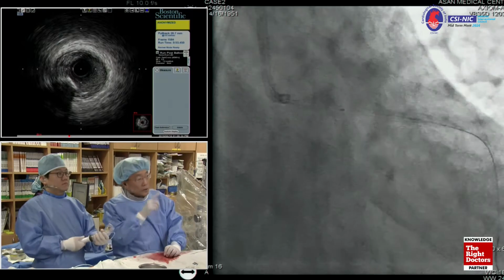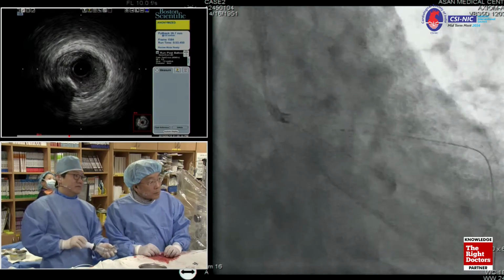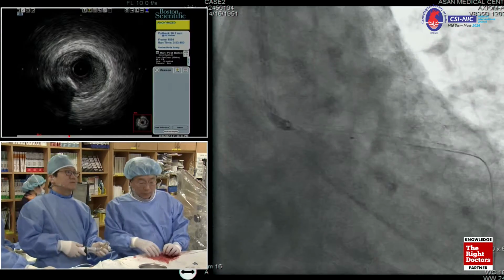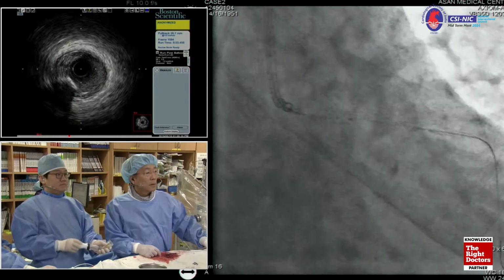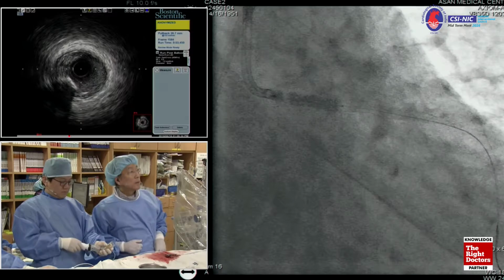High pressure. This is circumflex. I think we're running out of satellite time. There must be some overlap. Just a minute. Yes, we're running out of satellite time. All right, we'll probably have another few minutes, so we'll just be with you till you finish as much as we can.